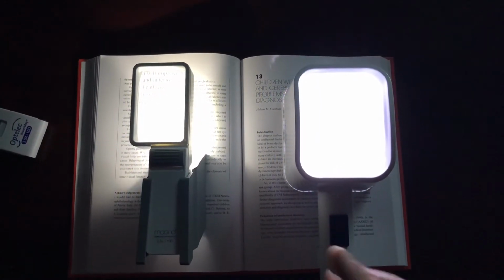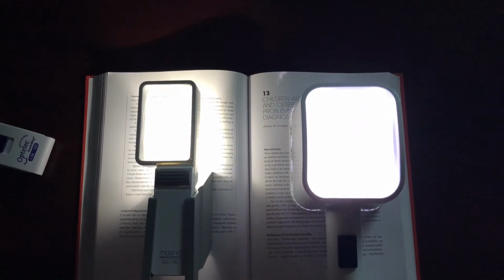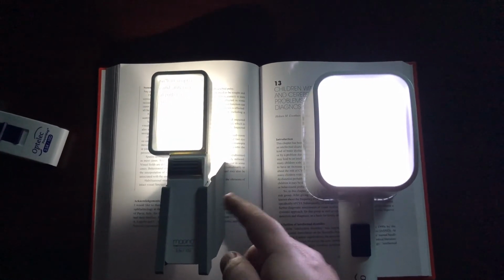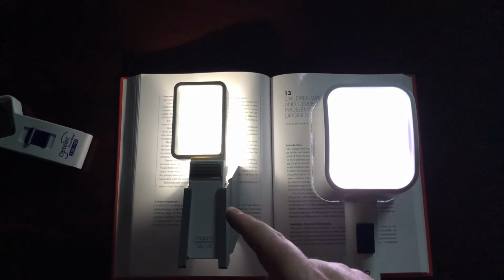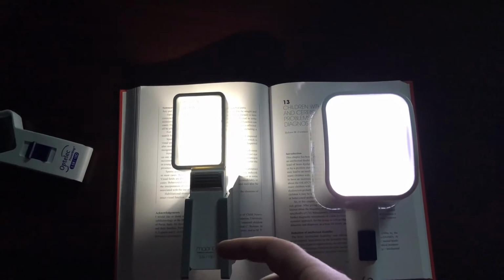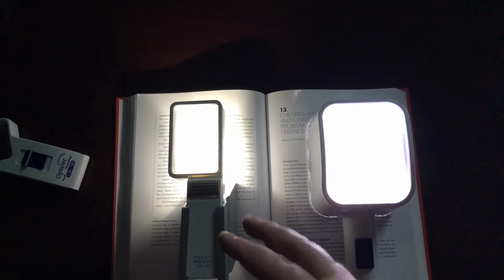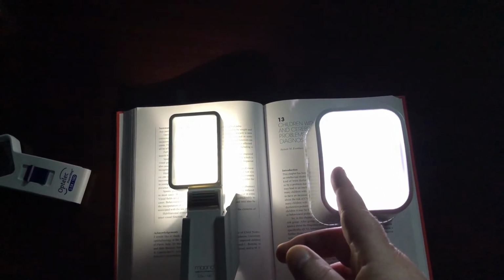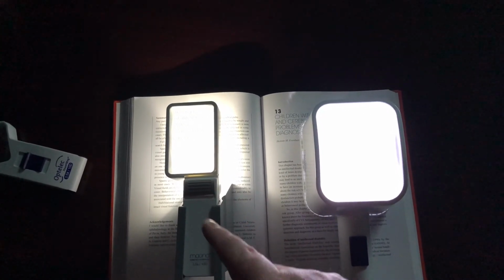Now, earlier I noted that the Powermag appeared to have more light contained within the viewing area of a stand magnifier as opposed to the Magno on a stand adapter. However, the distributor told me that the Magno has an adapter inside the battery compartment that will cause the energy to be sustained over a longer period of time. So in other words, this might be brighter now, but over a longer period of time you might get better performance out of the light on the left from the Magno.